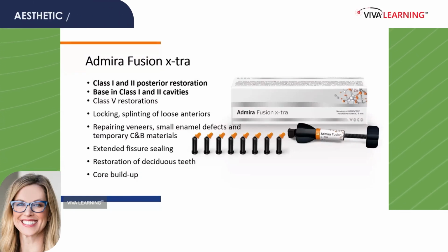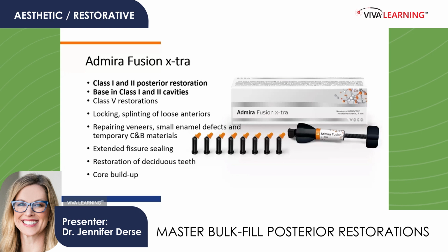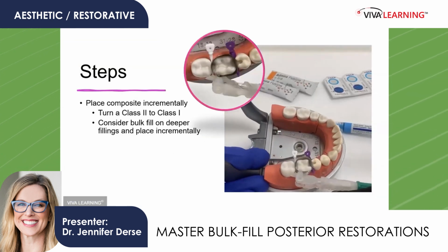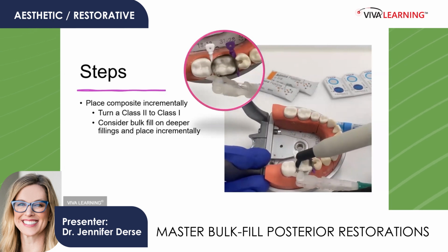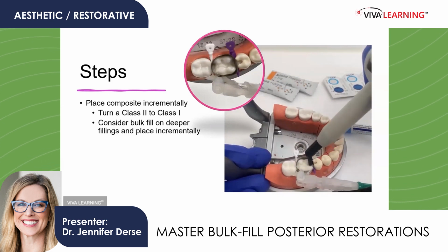We're going into using our Admira Fusion Extra today because this is a bulk fill composite. Also choosing it because we don't care about color. This stuff works for all the colors. It matches really, really well to everything. It's magical. You're going to turn your class 2 into a class 1. Again, it's nice to use the Admira Fusion Extra because it's a bulk fill.